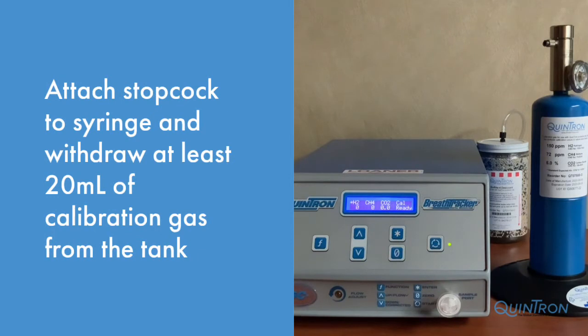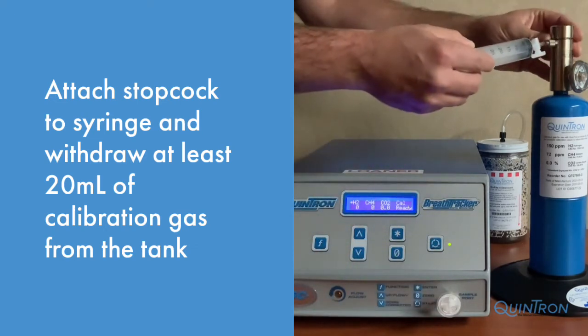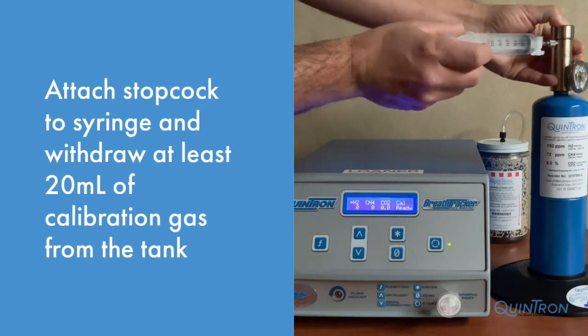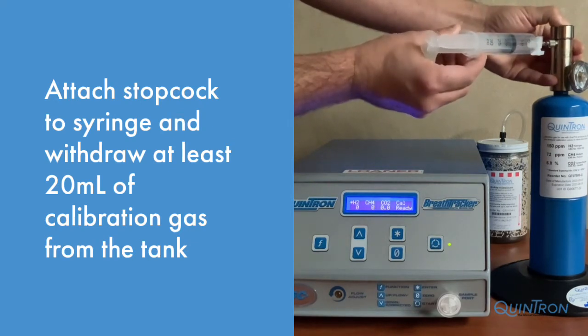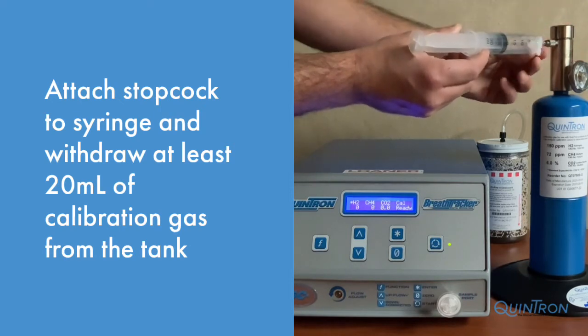Now it's time to inject calibration gas into your machine. Using your Quintron syringe, attach a one-way stopcock to the end of the syringe. Make sure that the stopcock is in the open position. Insert the syringe into the side of the pressure valve and press down on the valve to withdraw at least 20 milliliters. Close the stopcock.